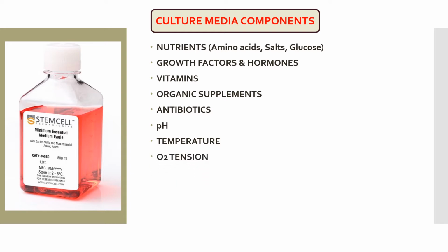providing the right oxygen tension. While most cells require oxygen for respiration in vivo, cultured cells often rely on glycolysis and may be anaerobic. So high oxygen tension leads to an increase in the level of free radicals in the medium. Cells only use dissolved oxygen, and so providing the correct oxygen tension is difficult, since it means fulfilling the respiratory requirement and avoiding toxicity at the same time.